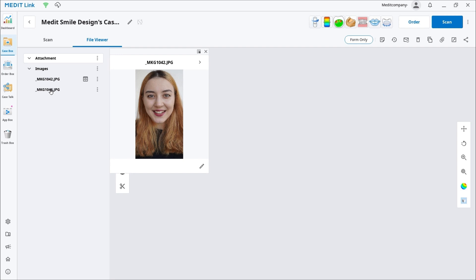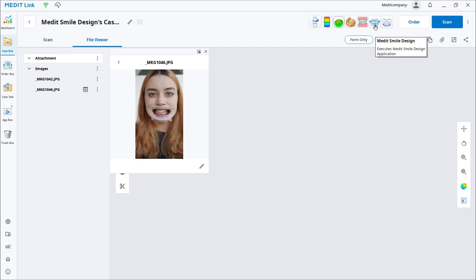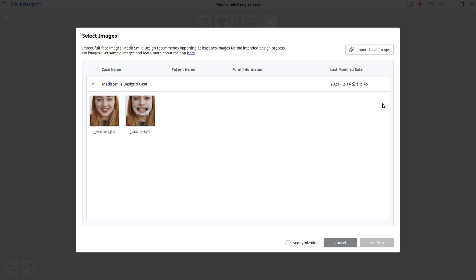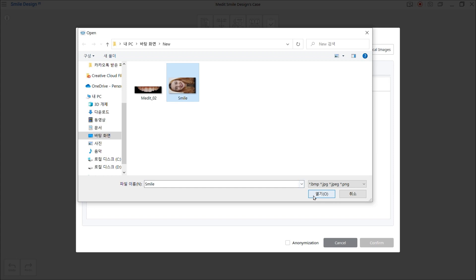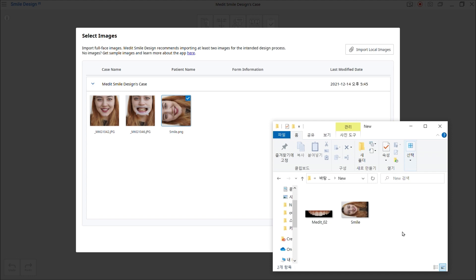If you already have the images readily available on your PC, you can run Medit Smile Design straight away. You will be asked to import images when the program runs. When the Import dialog window pops up, you can use Import Local Images to import images directly without having to attach them to your case. You can also drag and drop the images from your local PC. Select the images you need, then click Confirm.